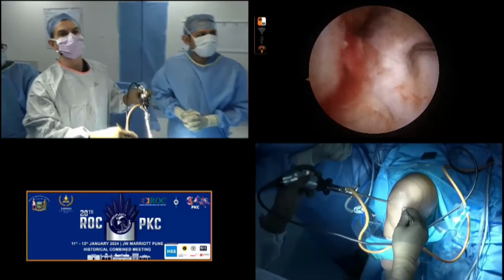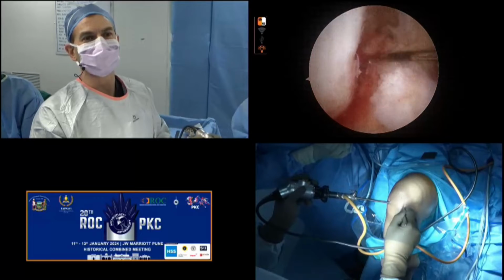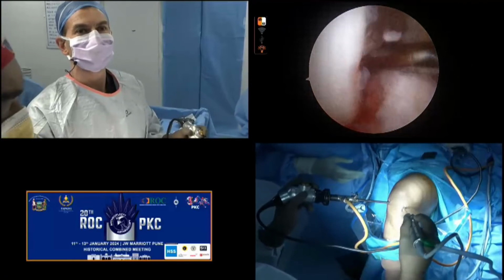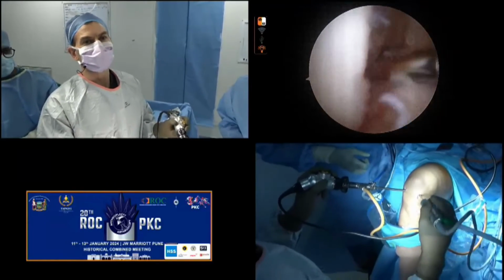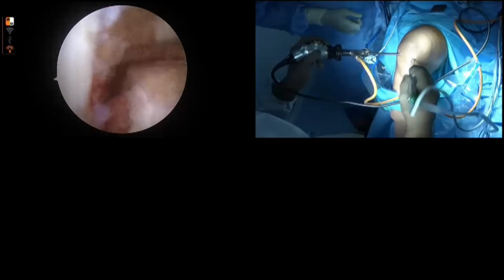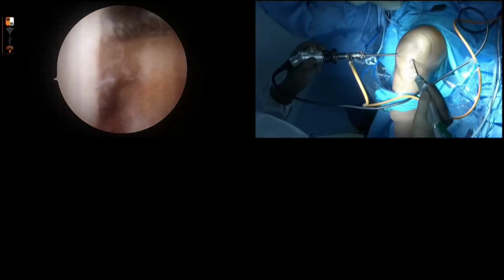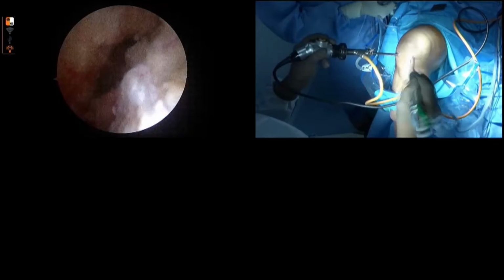We've talked a lot about stump preservation, but there is a stump and that is moderately preserved at the moment. If we just give it a little pump there, guys, a bit of fluid. I've already done a little notchplasty. Again, big fan of creating a notch that allows me, A, to get nice access, but B, doesn't impinge. And I always use my PCL as a guide. North-south, my PCL, and I like having my lateral condyle parallel to that.